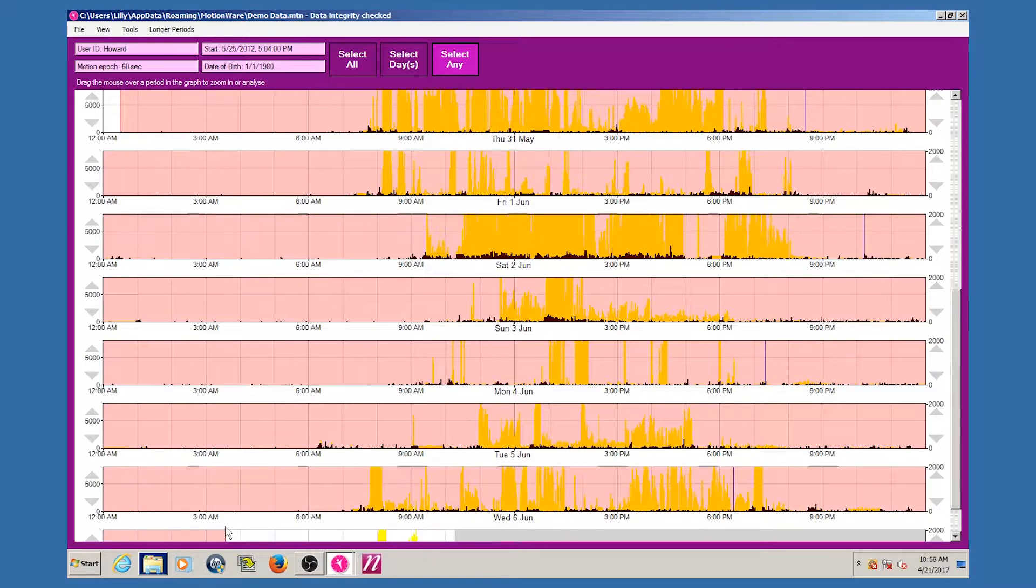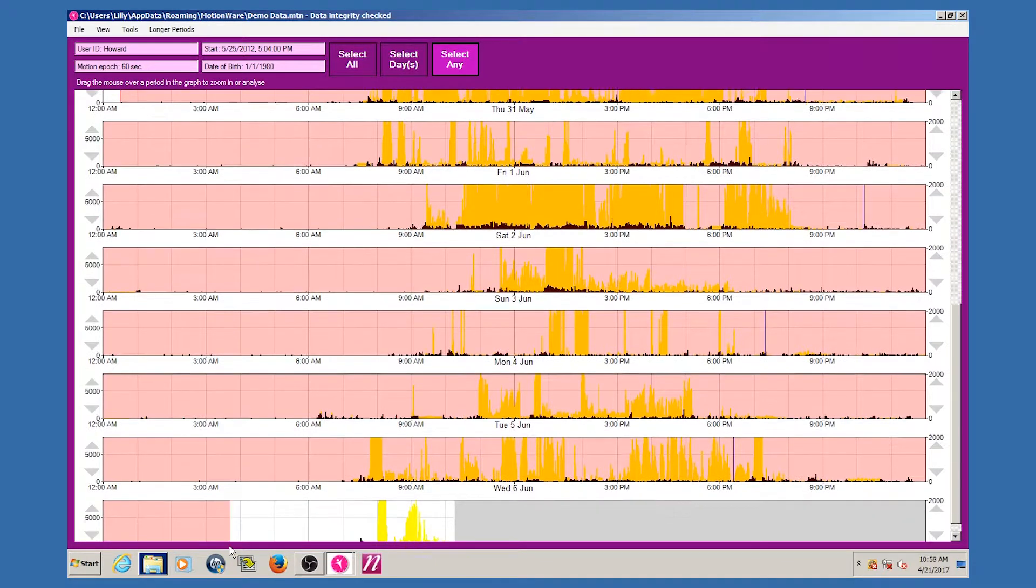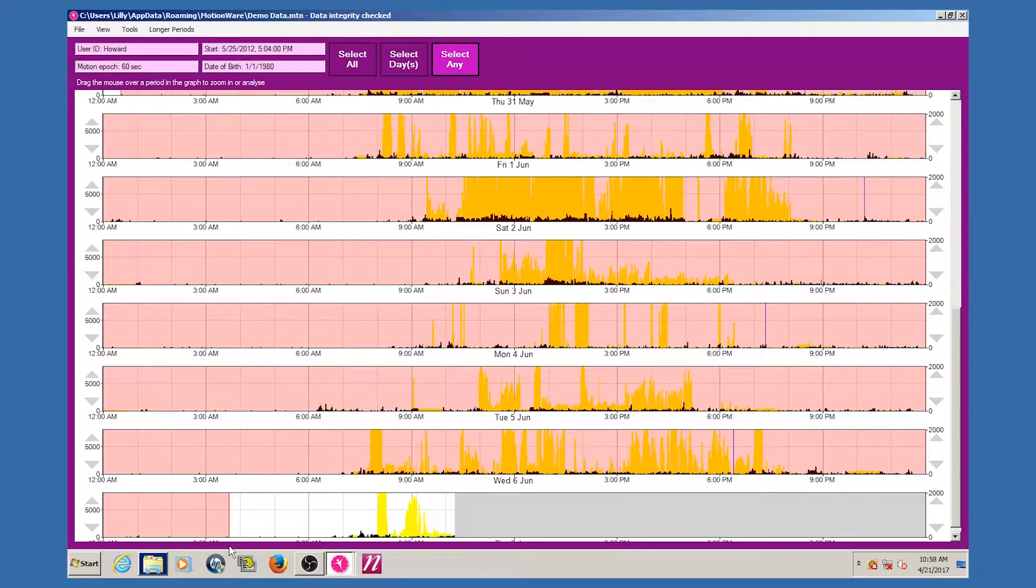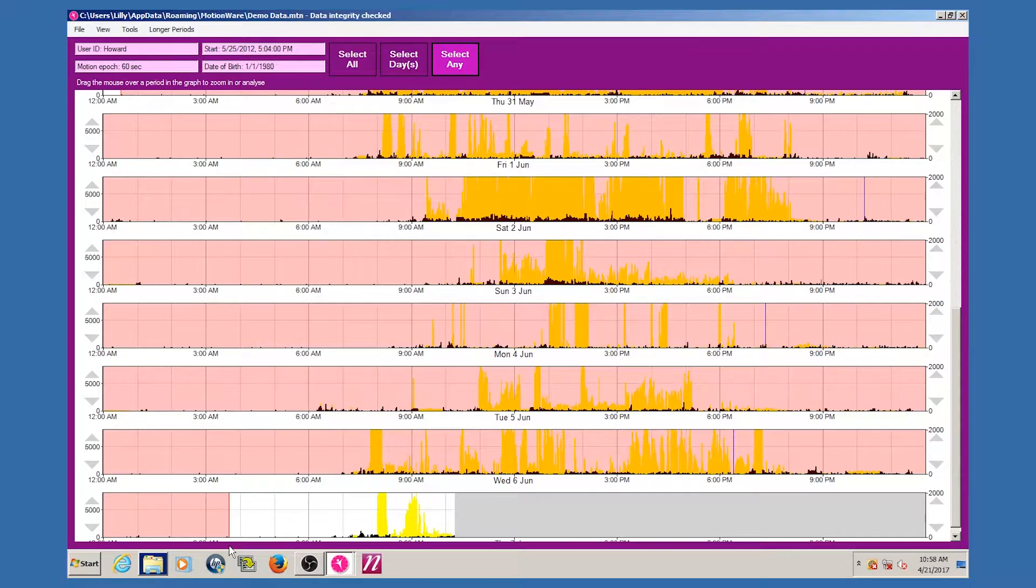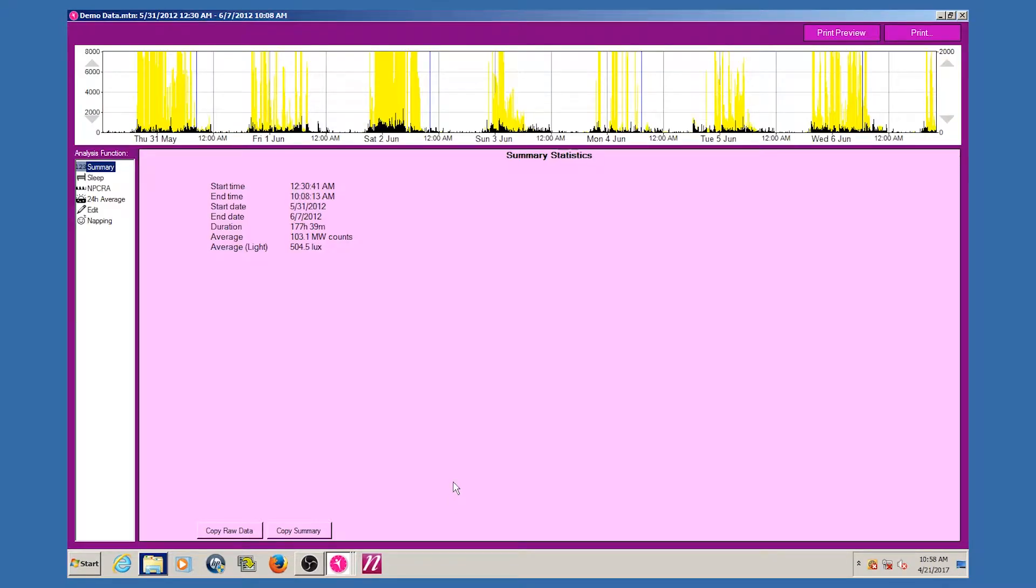By dragging off the bottom or top of the MotionWare graph area, the window will automatically scroll to allow selection of days that are not currently displayed.